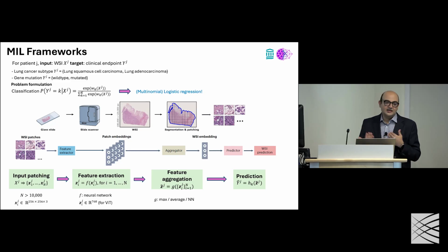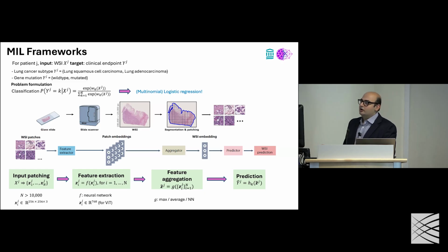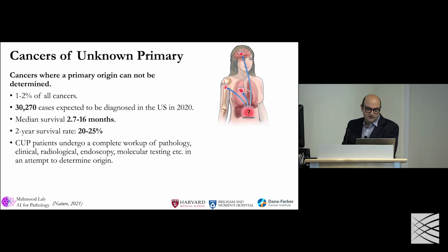And you can pose this as being any kind of machine learning problem. This could be a classification problem targeting disease detection, subtyping, grading, or it could be a prognostication problem where you're essentially solving a ranking problem, ranking patients into distinct risk groups, or it could be treatment response, anything that you practically have a label available for.